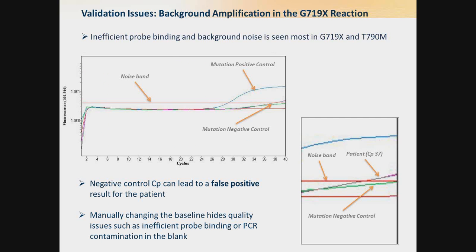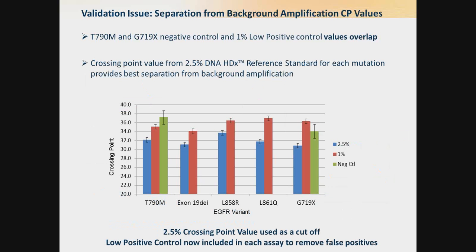Manually changing your baseline each run would hide quality issues such as inefficient probe binding, background amplification, or PCR contamination in the blank. Going back to the validation for these two variants, we see that the last dilution of 1% mutant allele frequency overlaps with the negative control. If we include an additional dilution of 2.5% allele frequency, we get good separation from the negative control. From this work, they decided to include a 2.5% crossing point value as a cutoff in every assay to remove the likelihood of false positives.